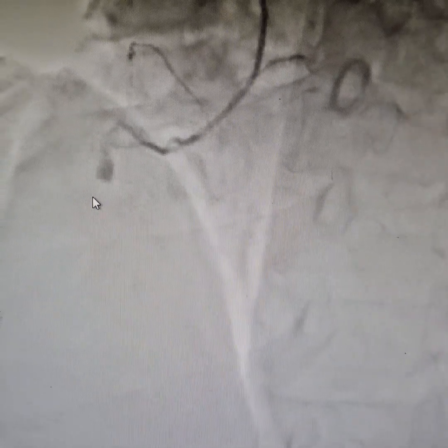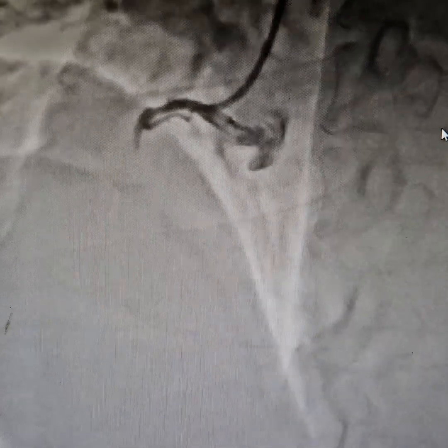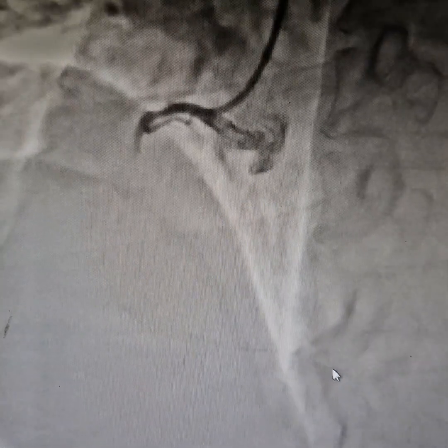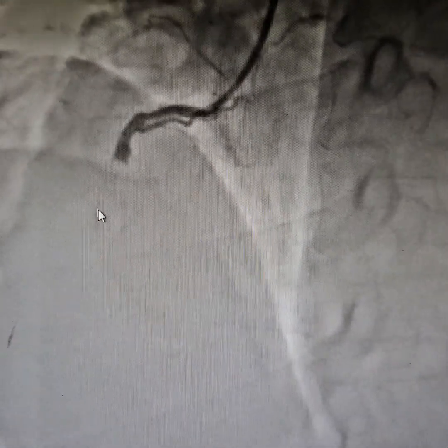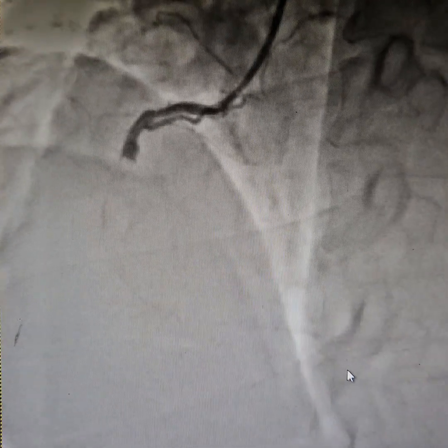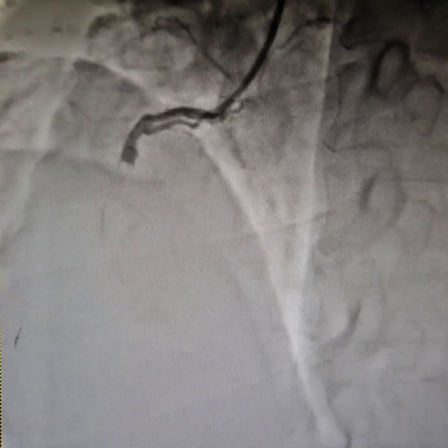We took him up for a primary angioplasty and stenting to the RCA. We have put a wire. The wire choice we took was a Whisper Extra Support wire. It has a medium tip weight — a good medium classification for penetration power — and is a very good wire for 100% thrombotic occlusions, as we have found. It finds very small microchannels quite well and quickly.